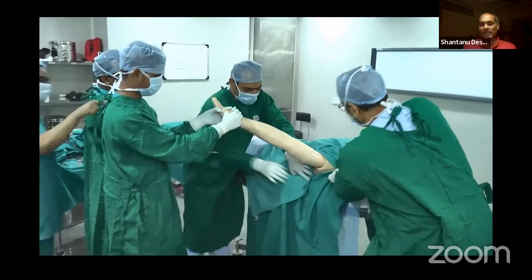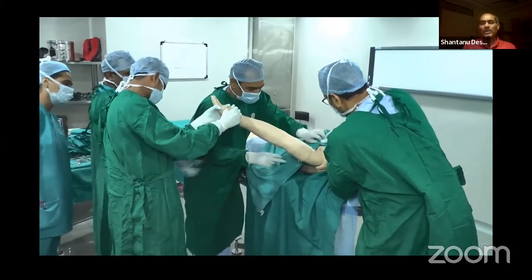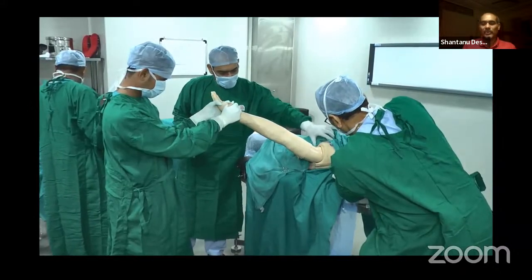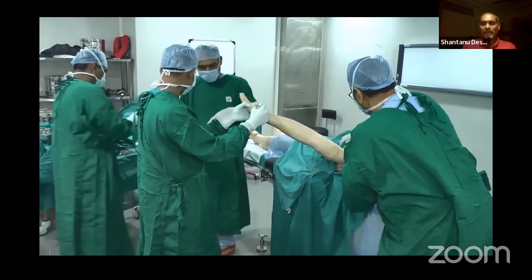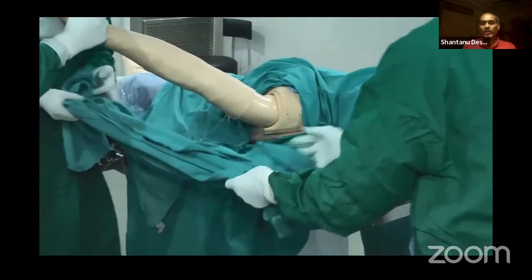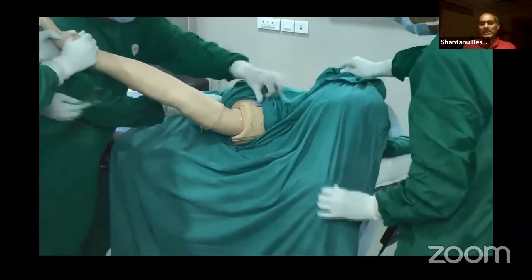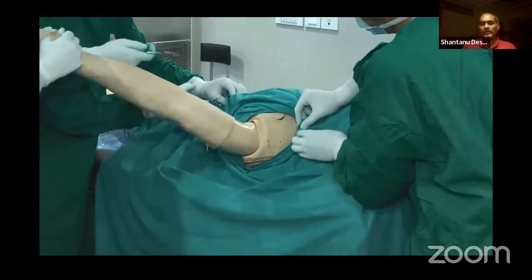The second drape comes in from the top. It is curved around the shoulder and then it is secured to the initial cloth drape that we used. One should make sure that it is not tightly bound, leaving an adequate gap on the anterior shoulder surface for extension of the shoulder incision if it is required, depending on the surgical scenario.